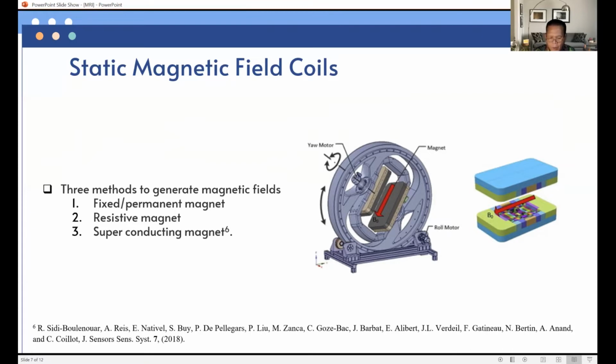Their low field strength of about 0.15 to 0.4 T restricts their use in diagnostic imaging, being impractical for spectroscopy, chemical shift and susceptibility imaging, such as functional brain imaging. Their magnetic field homogeneity is also sensitive to ambient temperature, so room temperatures must be controlled carefully.